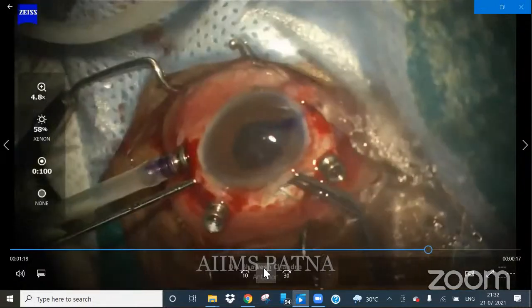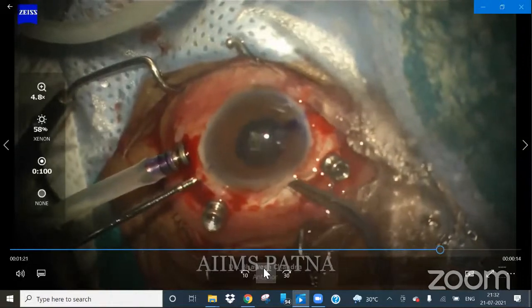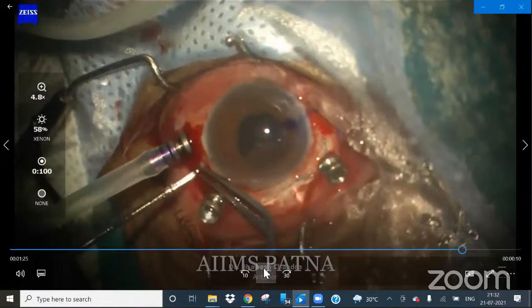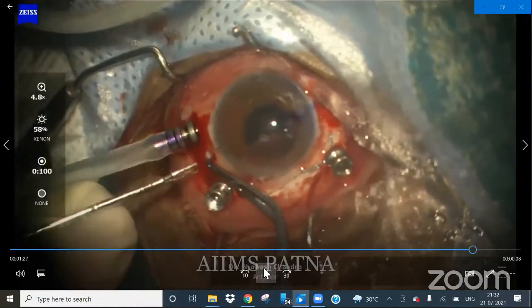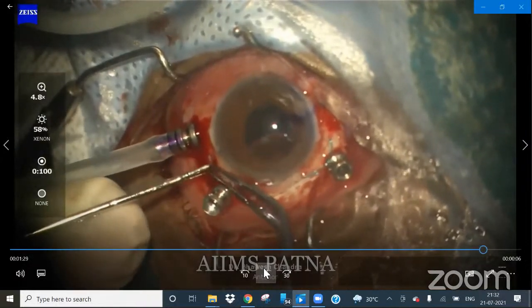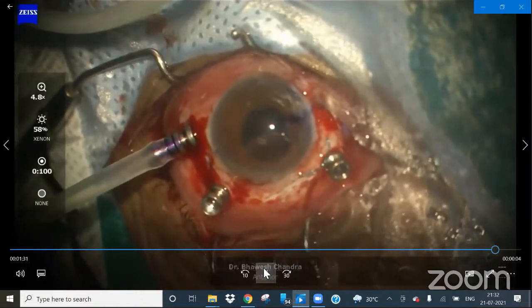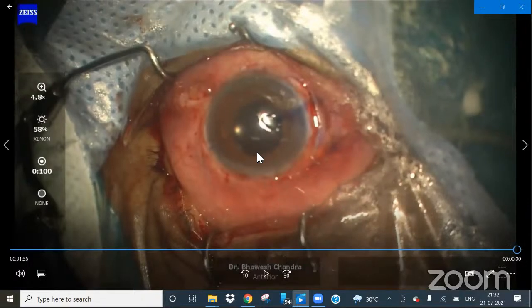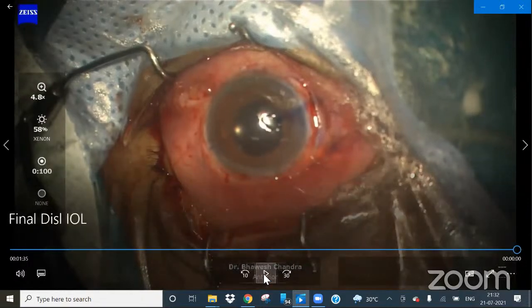Once this is done, in the same sitting, I implanted an SFIOL through the standard technique of extruding the one haptic out. And this is the final look after the implantation of SFIOL. This is the video. This is my surgery.